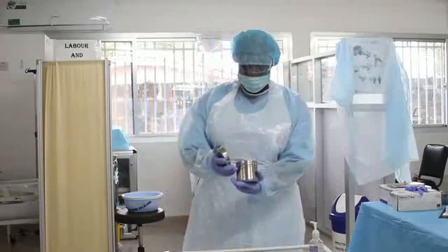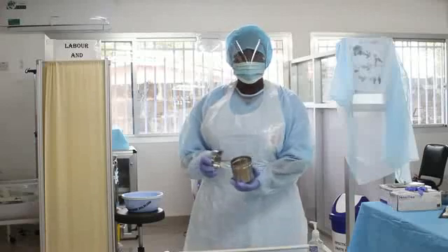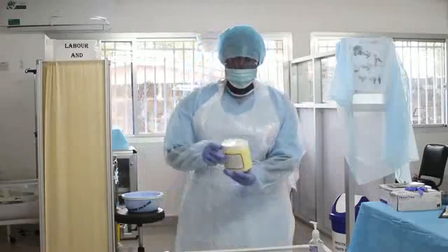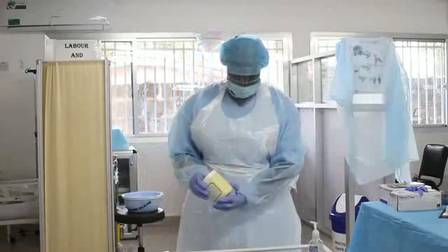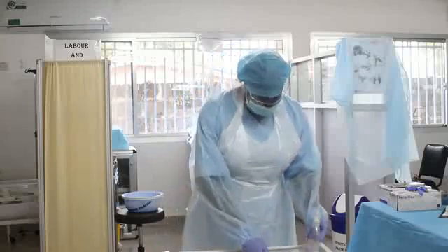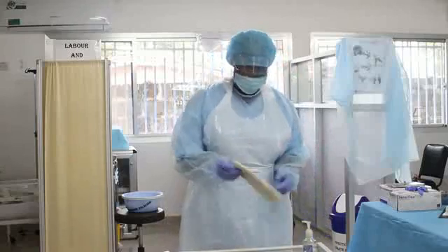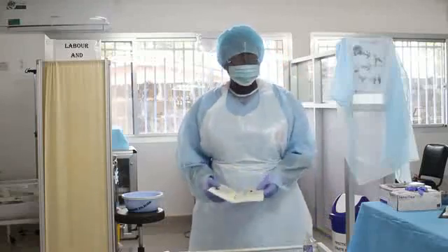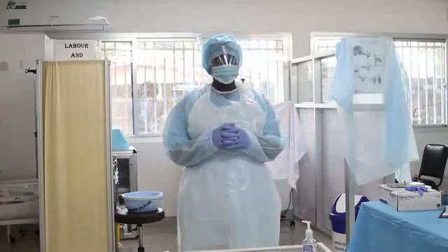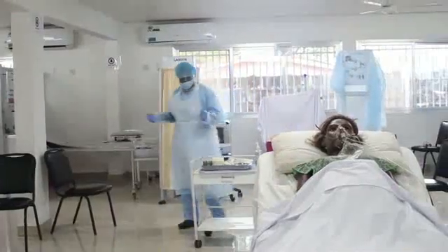and for care of the nose, I have Q-tips that I'll be using to clean the nose and at the same time lubricate the nostrils. And this is the lubricant, petroleum jelly, that I'll be using to lubricate the nose. Of course, I have my sanitizer for hand hygiene. And finally, I have the gloves for infection prevention. But first, I am going to my patient to explain the procedure.